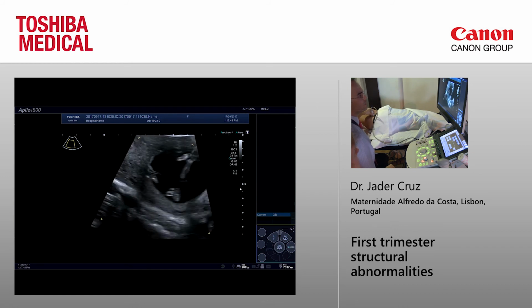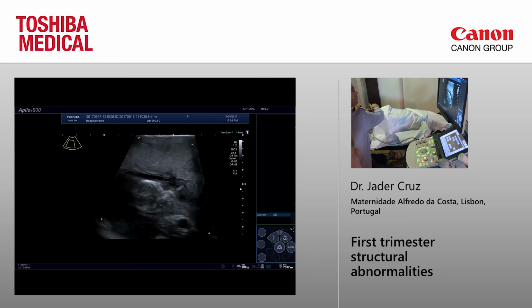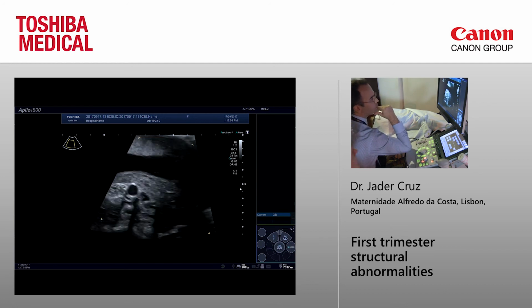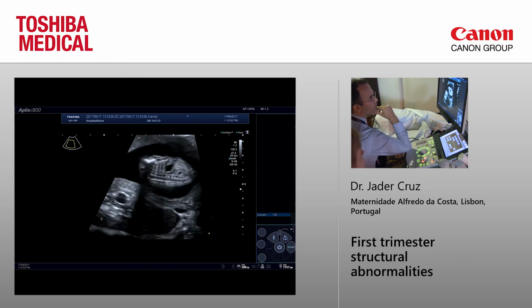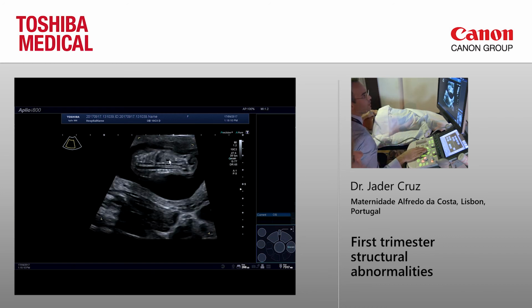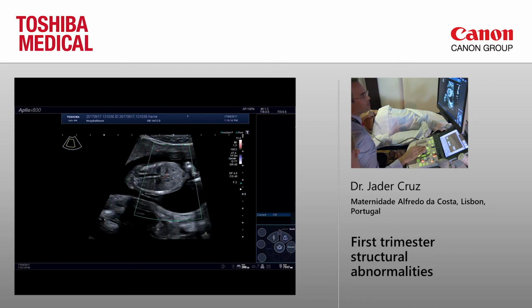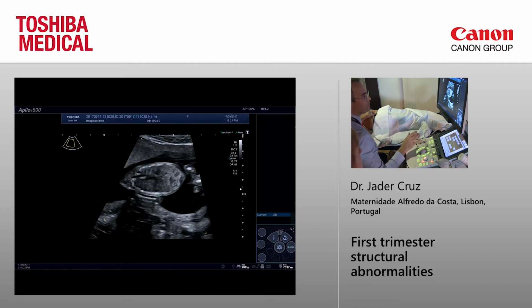and hand. Now the baby really decided not to behave. Hello, baby, move around. Spine. Well, every time I speak of something, the baby just decides not to show. The back, you see spine, you see kidneys there. The one kidney there, the other kidney is there. If you like colors, you can just try to show there with the high definition Doppler. But sometimes SMI also works here.